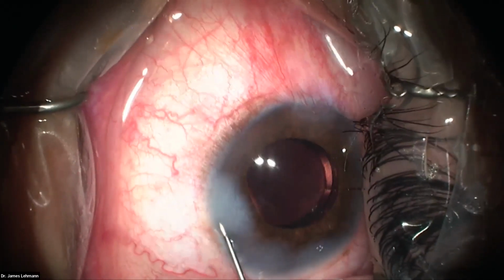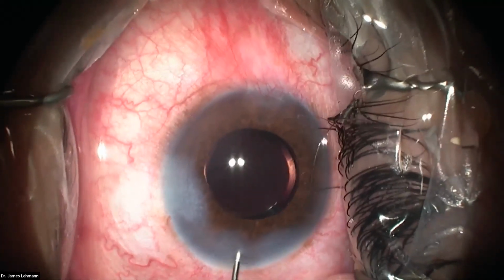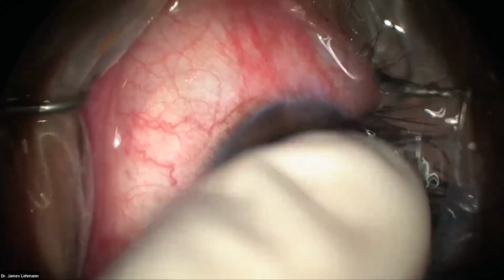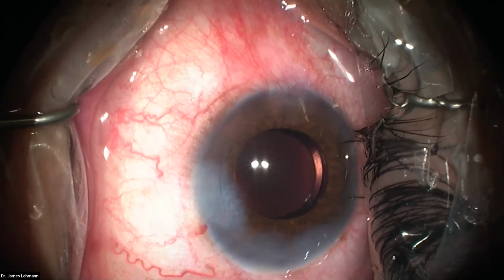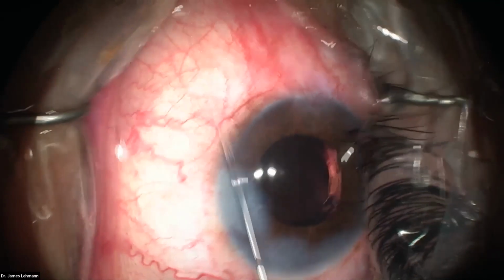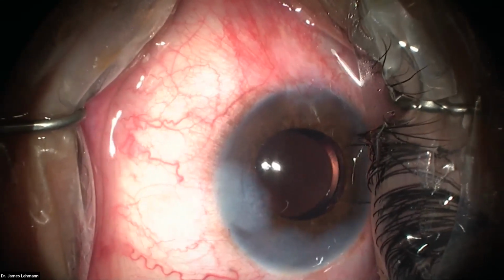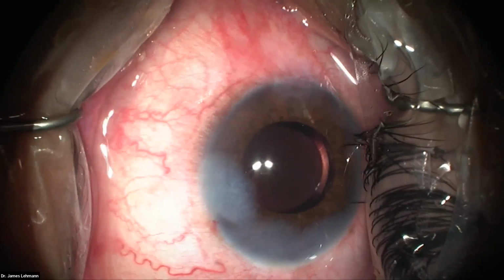And here I'm just filling the AC, checking the pressure. I'm going to do a little more stromal hydration here on the anterior lip of my incision. And then I'm injecting, I want to leave the eye pretty firm at the end of the case. We see some more BSS right here, thank you. So you can see all that whitening around there. That's fine. That goes away in a day or so. And then I touch it and I feel like the eye is firm. So then I know we're in a good spot. And so should be good pressure there. So we're pretty much done with this.